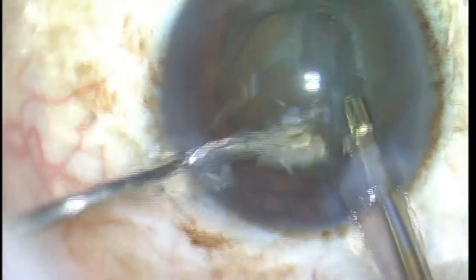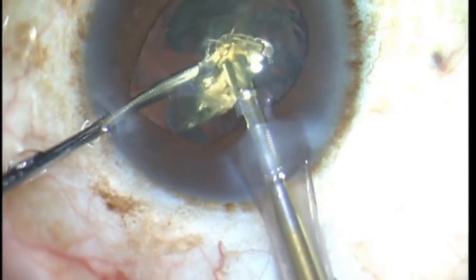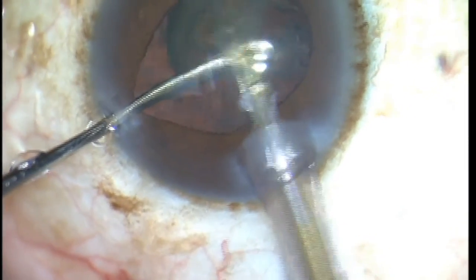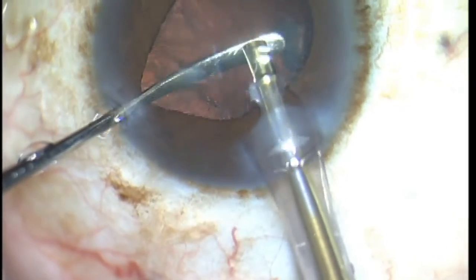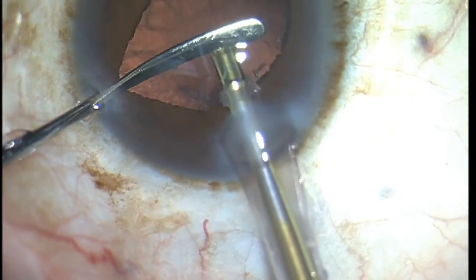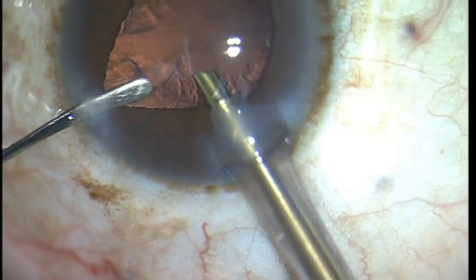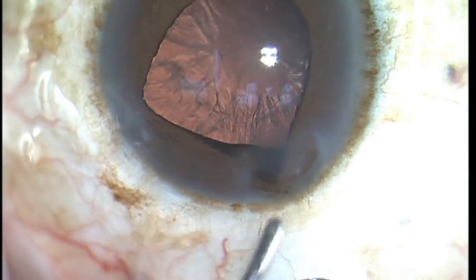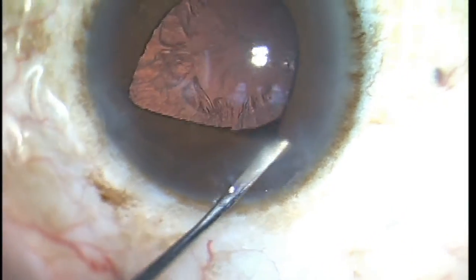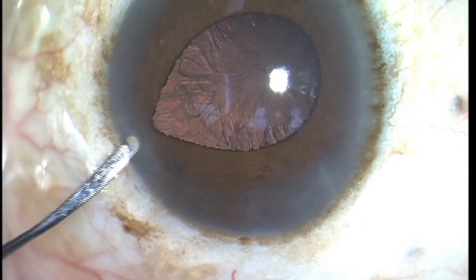We started out with a beautifully dilated pupil, and as I'm taking the last remnants of the nuclear fragments out, you can see that the pupil is no longer round — it's actually slightly peaked towards my side port incision. And now as I'm taking my phaco tip out, the iris is prolapsing through the wound. This patient has classic intraoperative floppy iris syndrome, IFIS for short.